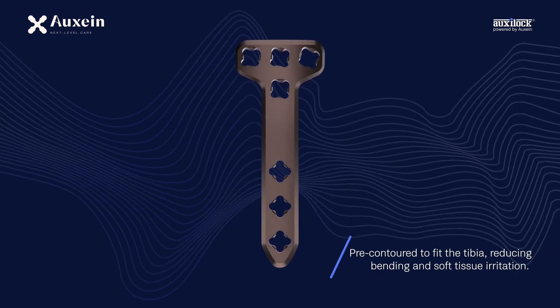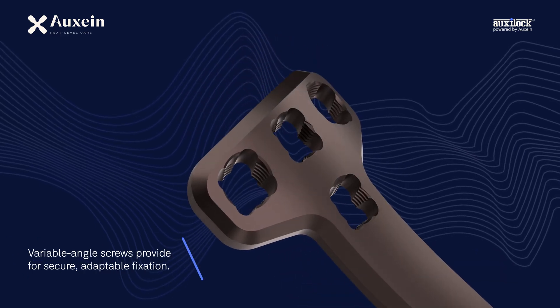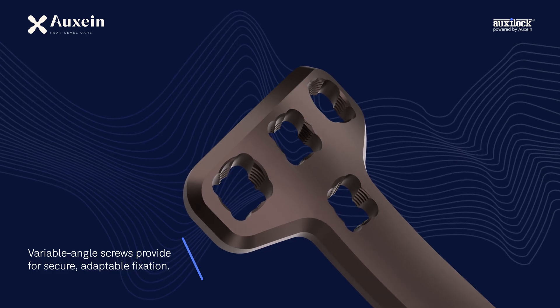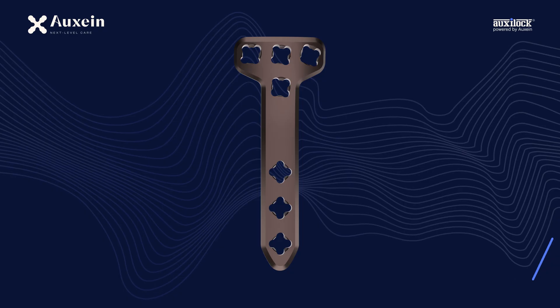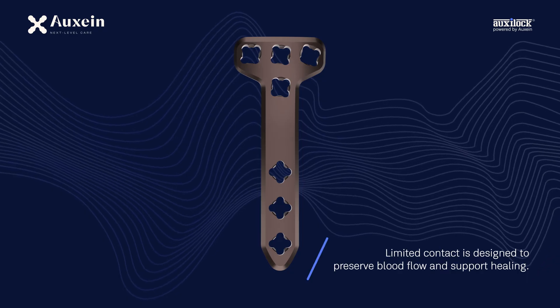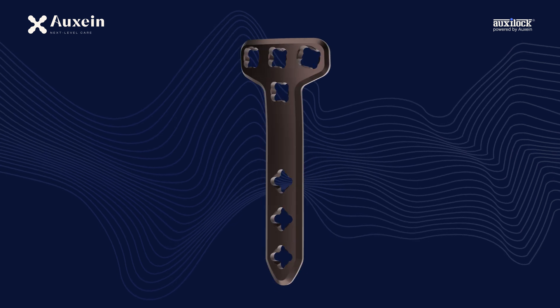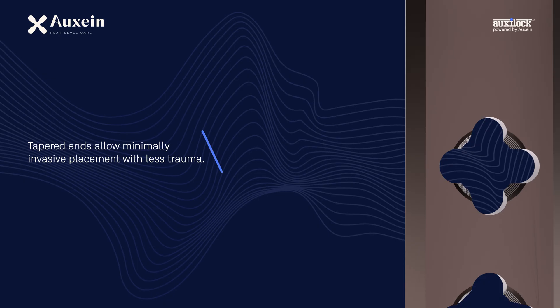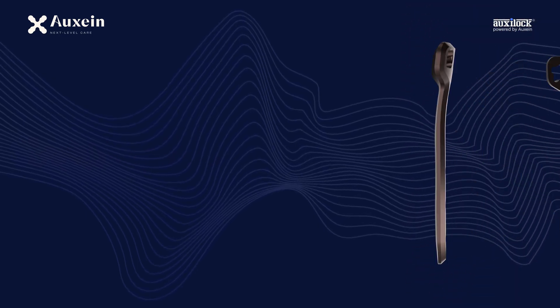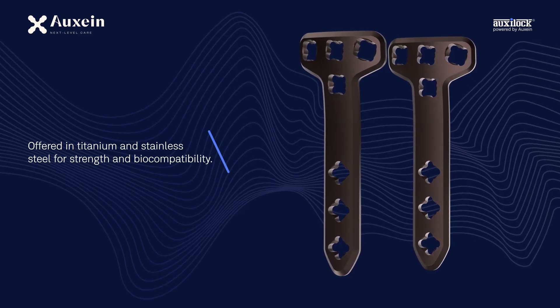The plate is pre-contoured to fit the tibia, reducing bending and soft tissue irritation. Variable angle screws provide secure, adaptable fixation. Limited contact is designed to preserve blood flow and support healing. Tapered ends allow minimally invasive placement with less trauma. Available in titanium and stainless steel for strength and biocompatibility.